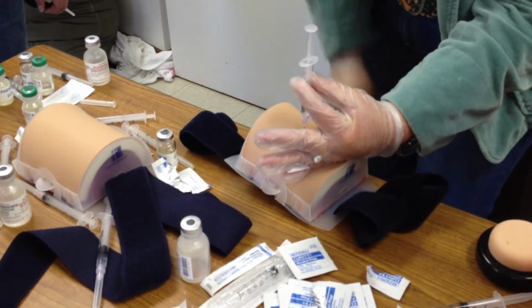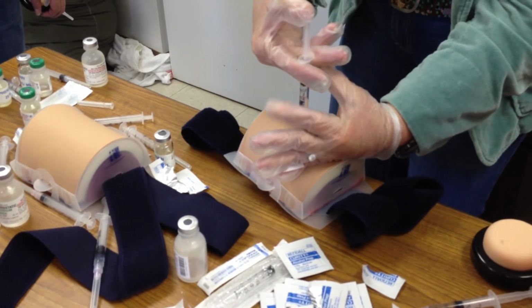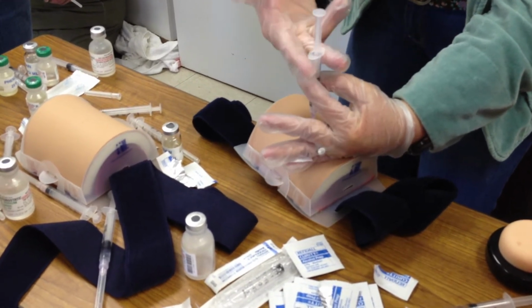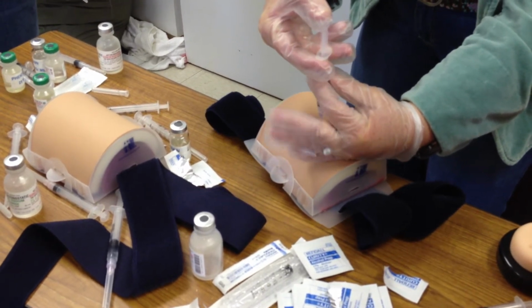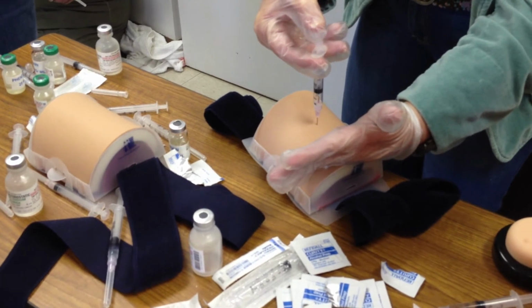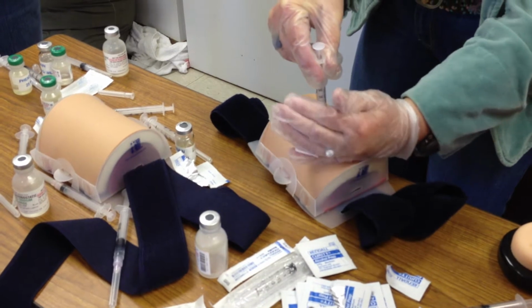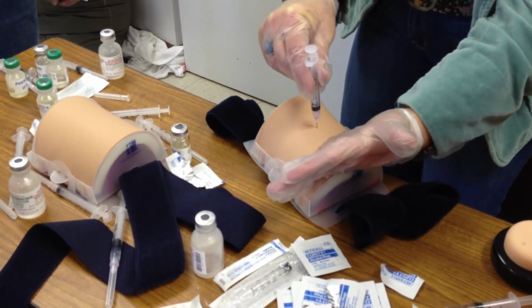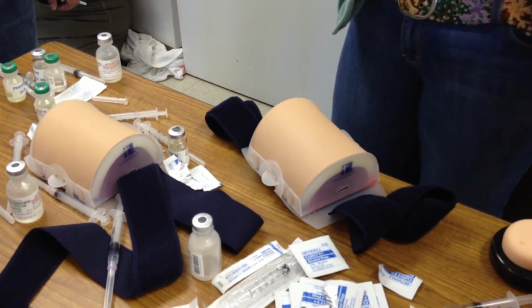Okay? So now we're good. I've aspirated. We're good to go. Nothing's in there. Now I'm going to reach right here and use your fingers to use the barrel to offset the pressure, and you can hold the whole time with your pincher fingers, or you can choose not to, because I've got a stable hold with this hand. Slow and easy, inject my medicine, including the air that came out of the tissue. Okay? Now this hand is folded out of my way. I'm going to come straight out the same angle I came in, and then you're just going to let go.